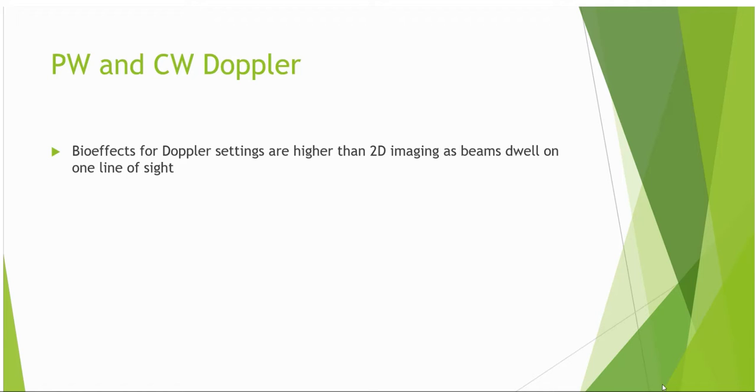We will also note that the potential bioeffects from Doppler are higher compared to 2D imaging. This is because the ultrasound beams dwell along one line of sight, and in addition, pulsed wave applies high voltage to the crystal to ensure the requirements for beam formation are met.